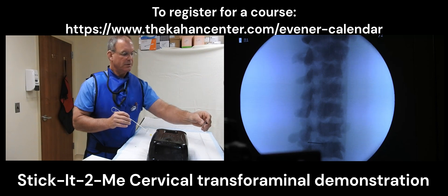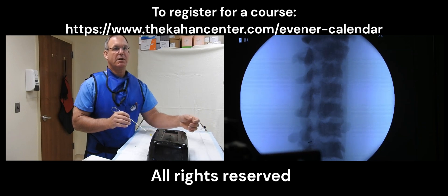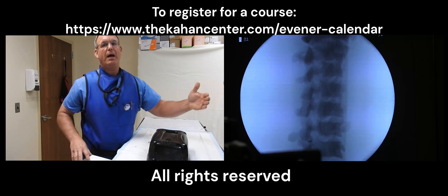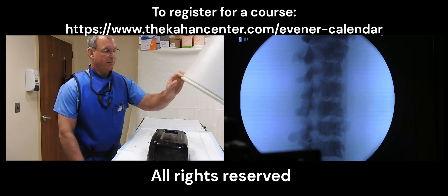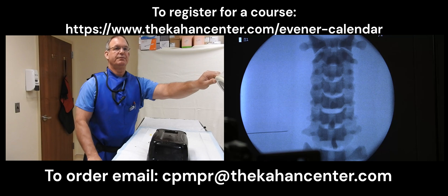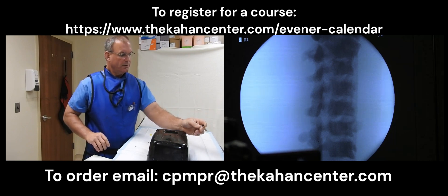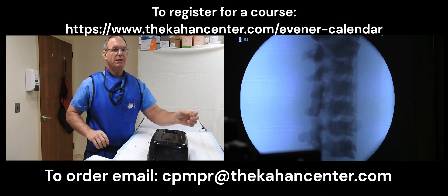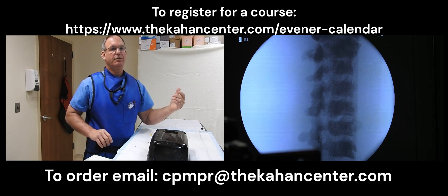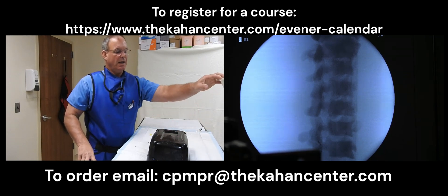As you can see the needle is starting to curve into that posterior aspect. In addition to that I try to contact the bone underneath me so that I know that I'm in my safe zone. Once I get to a comfortable depth I will then confirm how far medial I have moved under a PA view. You can see we're still pretty far out there but it's better to be safe. Now we will work our way so that the needle goes slightly more medial and continues into the posterior inferior aspect of that neuroforamen. We'll continue to advance it. As you can see I'm staying on a straight line and now I will check again my depth.